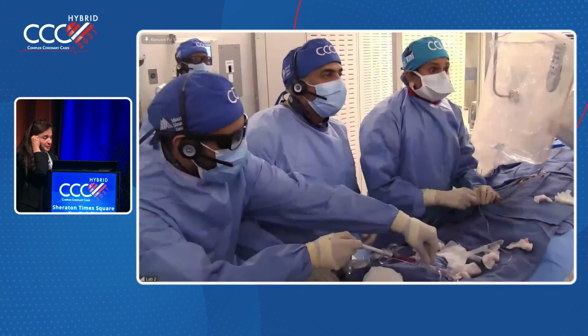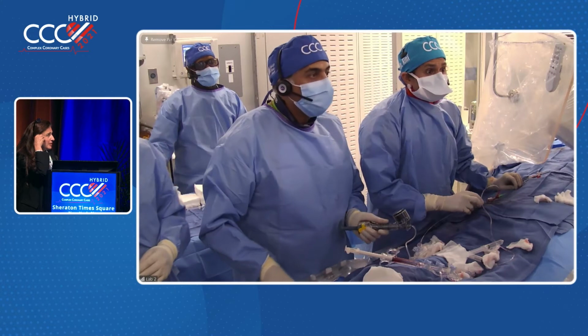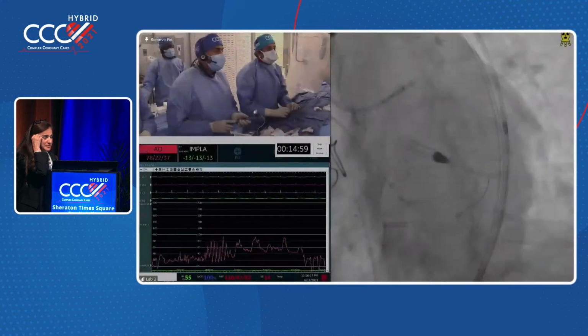Okay. So what's next? Looks like you're putting in another stent. This one is a 12 or 15? Approximately, we need another stent. Okay, can we see the left fluoro, please, instead of the... Thank you.